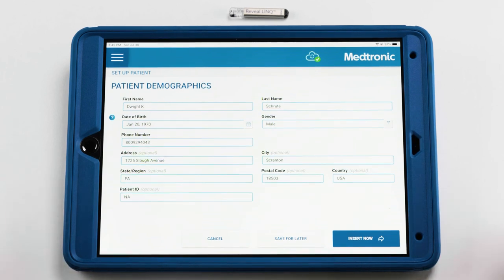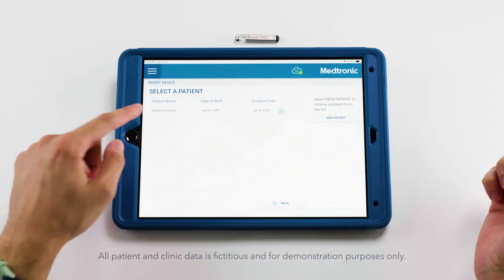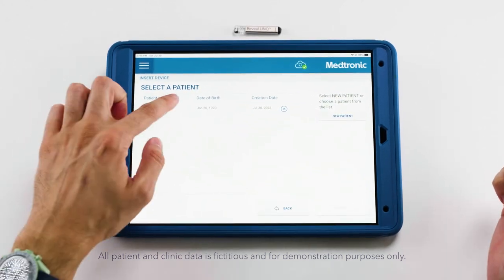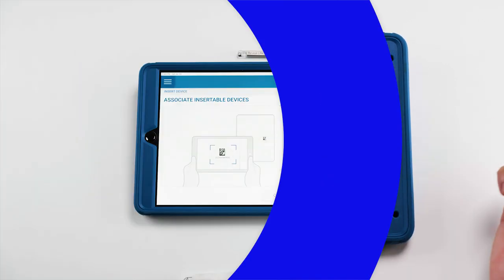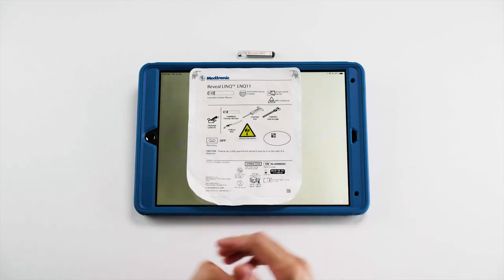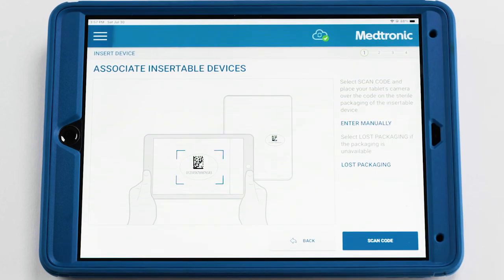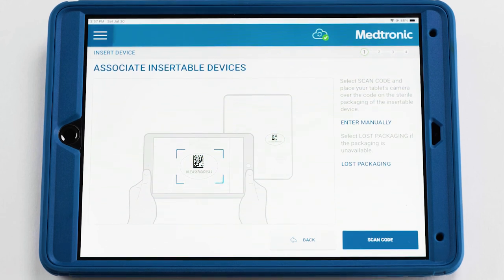Now that we've completed all of the fields, we can save this information for later and retrieve it on the insertion date. We've arrived on the day of insertion — we're going to click 'insert device' and our preloaded information from prior will be located here. We can select it and hit continue. You'll be prompted to associate the device with a patient; hit 'scan code' and using the camera of the tablet, locate the QR code on the back of the Medtronic Reveal Link packaging. After connecting the device, the next step is to associate the MyCareLink home monitor with the patient by scanning the monitor packaging using the tablet camera. Doing this will allow the home monitor to send data from the Reveal Link to the CareLink network from the comfort of the patient's home.